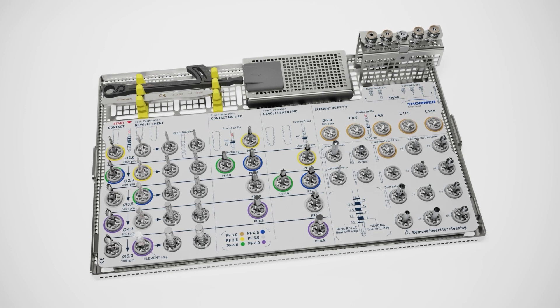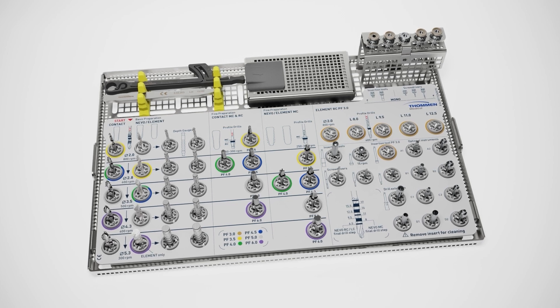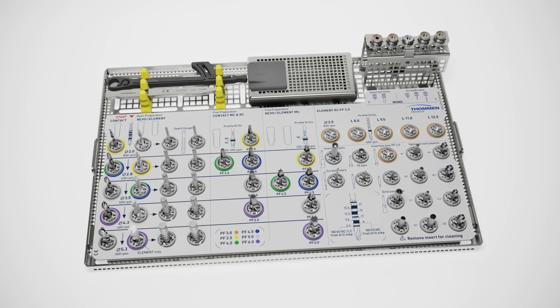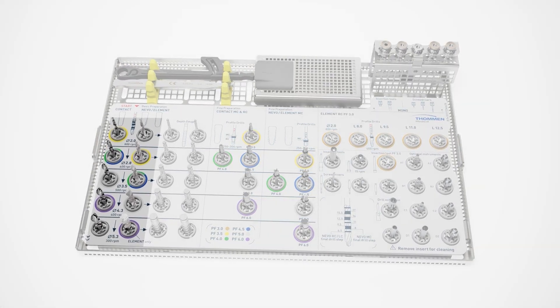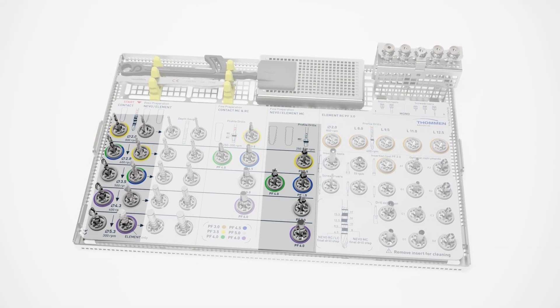The same surgical cassette can be used for Nevo, Element, and Contact implants. Implant bed preparation for Nevo requires the same vector drills and profile drills as needed for Element.